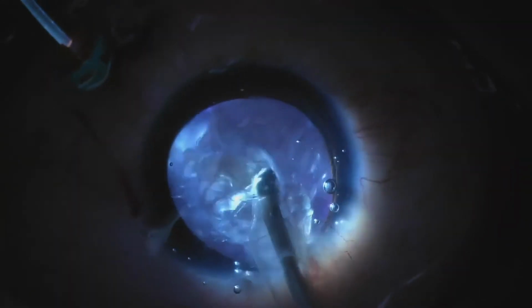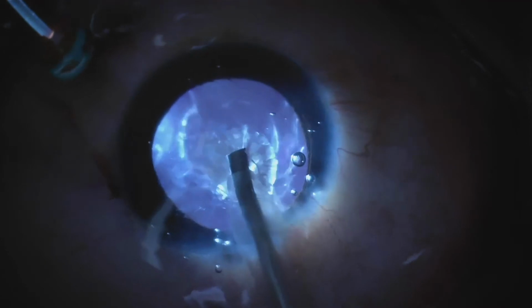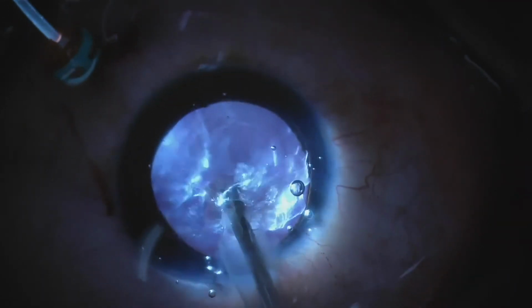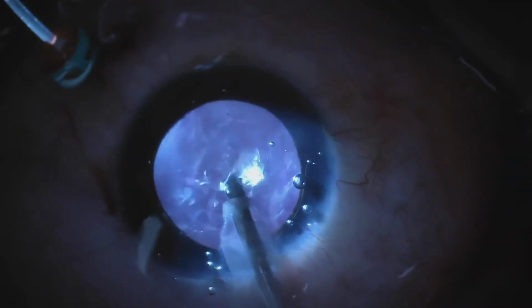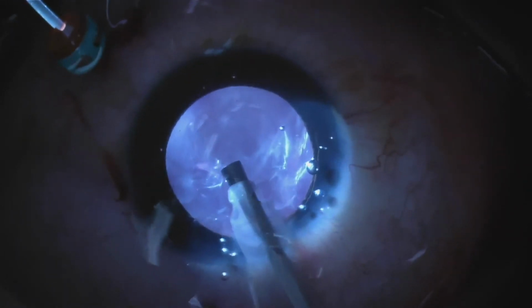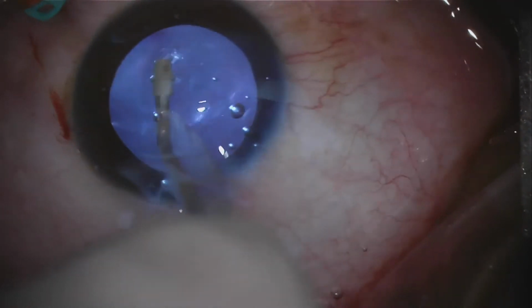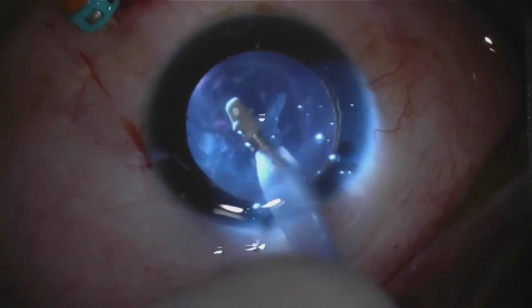One major advantage of using the chandelier as opposed to the light pipe for retroillumination is that the surgeon can use both hands throughout the duration of the cataract surgery. Because the surgeon does not have to worry about maintaining the positioning of the light source, he or she can focus on the difficult cataract surgery at hand.